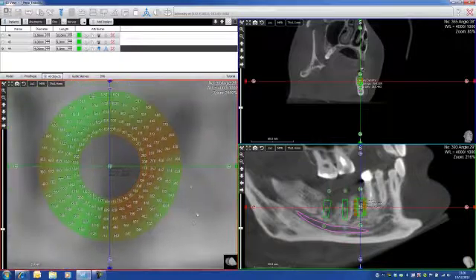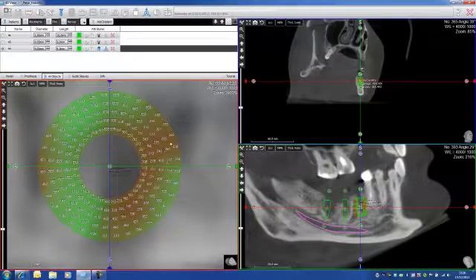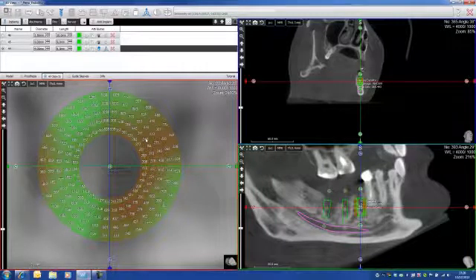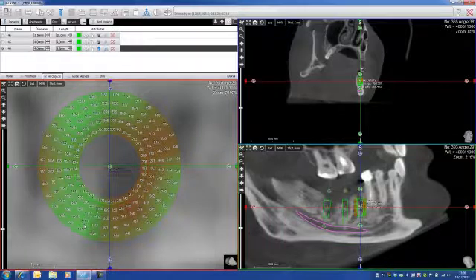To simplify, when it's red, it means that it's below the normal density of the bone. If it's over 400, it will show up in green, and it will mean that the bone is stable enough, is dense enough.